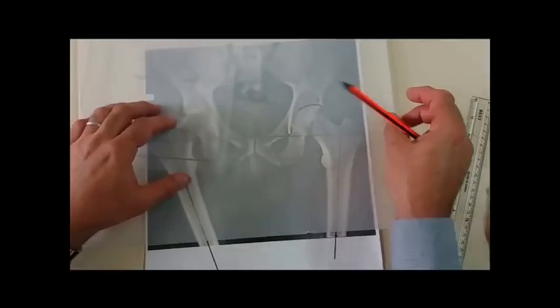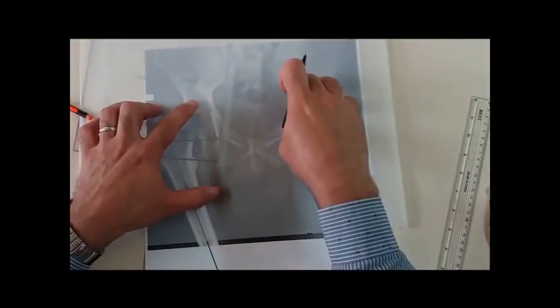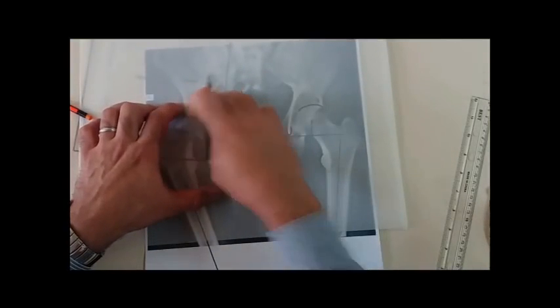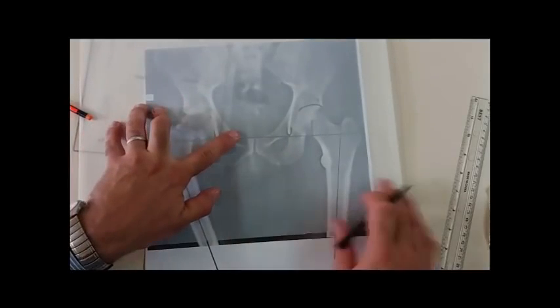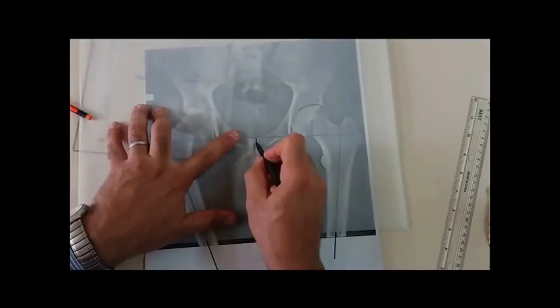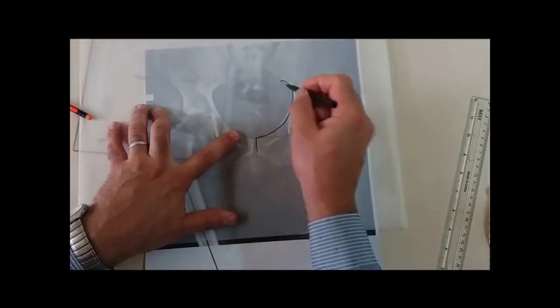What I will do in this step, I will draw what is shown in the pelvis, all the pelvis, the normal and the abnormal side, together with the acetabular cup. I will mark it on this tracing paper. So I will start tracing this hemipelvis, the normal hemipelvis.